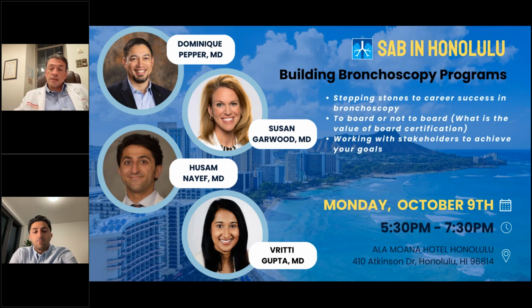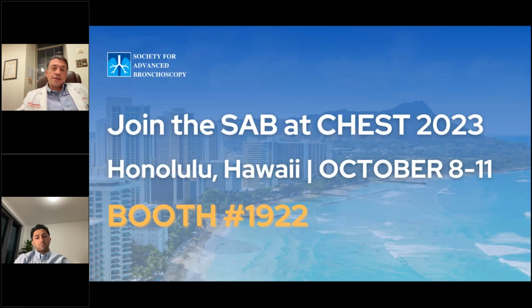If the CAT scan does not show lobar atelectasis, we look at the PFTs, we look at their symptoms. Now, what is very interesting, and I've noticed this in my patient population, we haven't published on this yet, but we should, if we can get around to it. There is a subgroup of patients that do not develop lobar atelectasis, yet objectively and subjectively they're feeling much better. So their residual volume goes down, their FEV1 improves, and they have no improvement on the CAT scan.